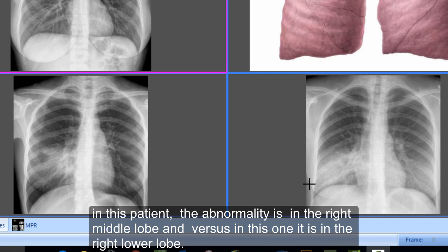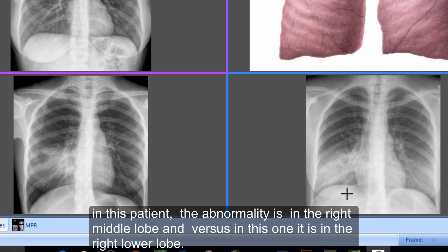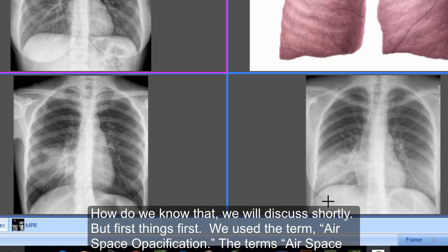In this patient, the abnormality is in the right middle lobe, whereas in this one it is in the right lower lobe. How do we know that? We'll discuss shortly, but first things first — we use the term airspace opacification.